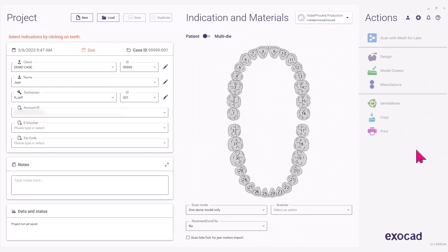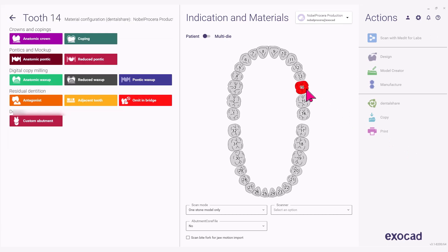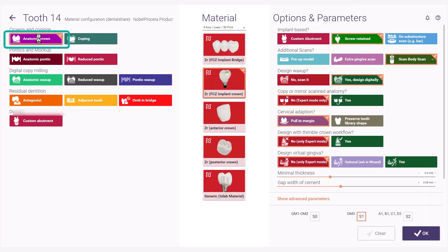Select the tooth number in the chart for the restoration. Select Anatomic Crown, followed by the Noble BioCare Zirconia FCZ Implant Crown in the material selection.